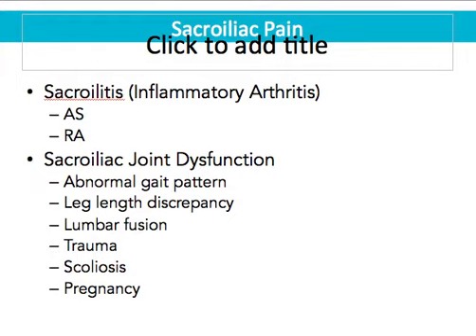But what you'll find typically is an SI joint dysfunction where the SI joint is actually trying to fuse onto the sacrum, so the iliac crest is fusing to the sacrum. Not good. And the way you find the SI joint is with the PSIS. One of the easiest ways when you're marking your landmark is to do it right there in the room.